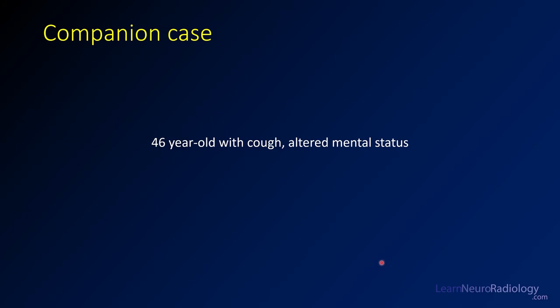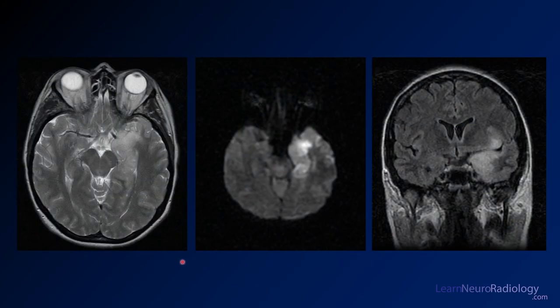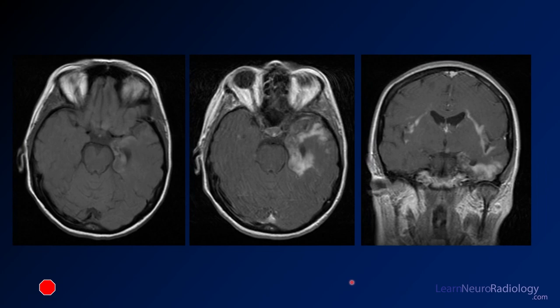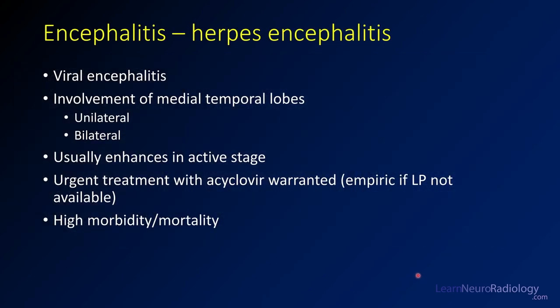The companion case is a 46-year-old with cough and altered mental status. You see a T2, a diffusion, and a coronal FLAIR. Look at the left hippocampus — the left medial temporal lobe, hippocampus, and amygdala are very bright on T2, very swollen, with loss of gray-white differentiation. On diffusion it's very bright and very swollen, confirmed on FLAIR where the medial temporal lobe going up to the sylvian fissure is very swollen and very T2 hyperintense. On post-contrast, there is avid enhancement — almost nodular and cloud-like — in the medial temporal lobe, with enhancement along the sylvian fissures bilaterally, left worse than right. When you see this much diffusion abnormality and this much enhancement, you really need to think about herpes encephalitis.